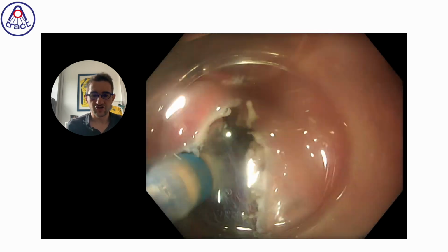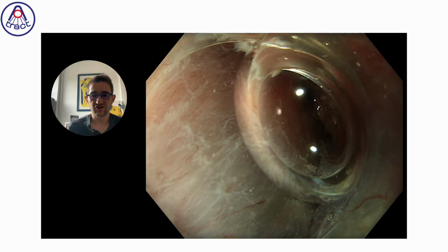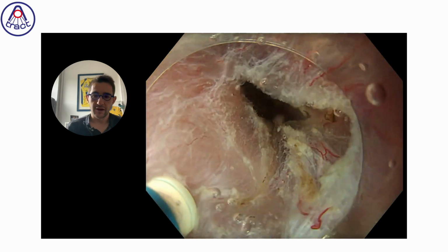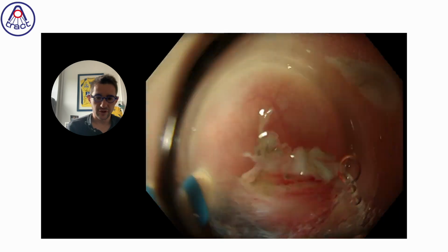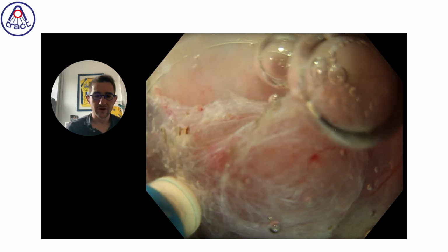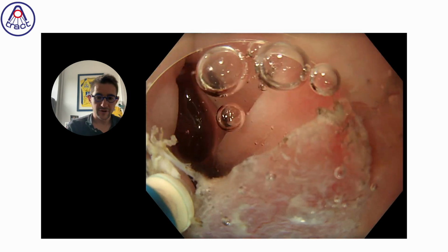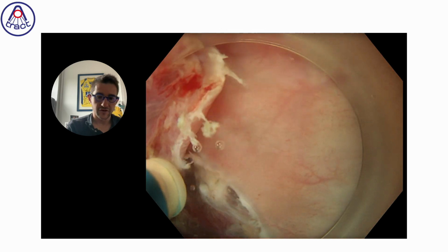It was a small lesion, so finally we decided to avoid using traction and to use an underwater strategy in order to save clips and save waste using the same material. And I think I took the end again for the end and the underwater strategy, because the fellow was not really used to underwater strategy, and therefore we did first the most difficult part, I mean the left side, because it was at the bad gravity side, and therefore we did the right one.